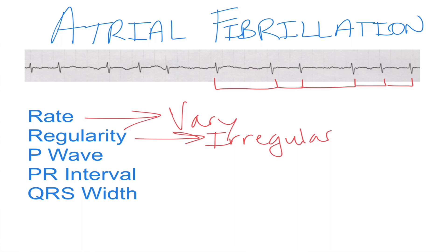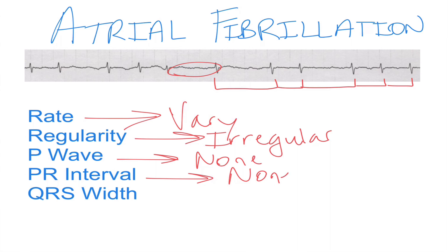You'll also notice that there is no P wave — it's just a squiggly line that is not discernible as any major structure in the EKG. Because there's no P wave, there is no PR interval, and the QRS width is going to be normal for atrial fibrillation rhythms.